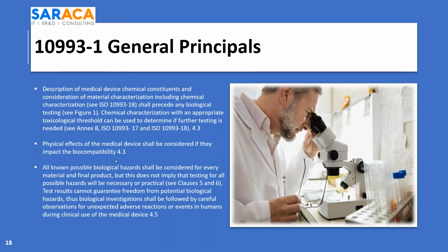Are you seeing any adverse events coming in through your post-market surveillance that indicates a new biocompatibility issue is there? And if it is, you have to run through your risk management process and determine whether that risk is acceptable.